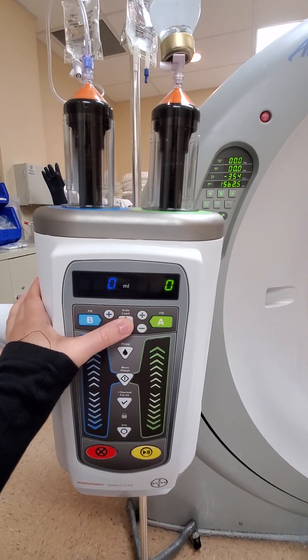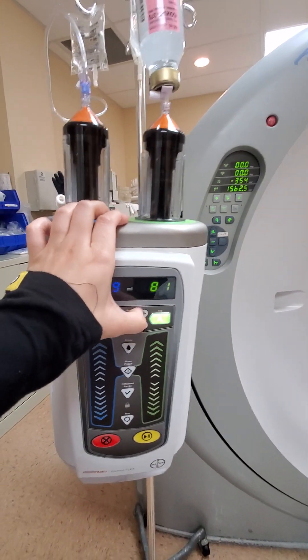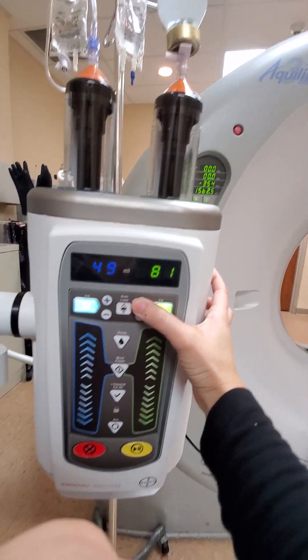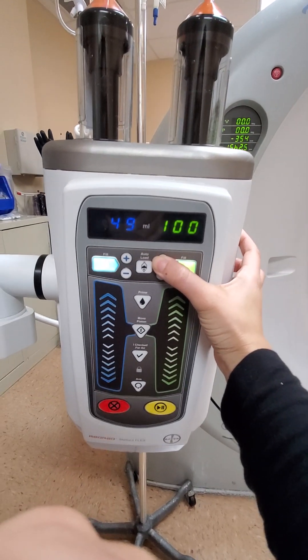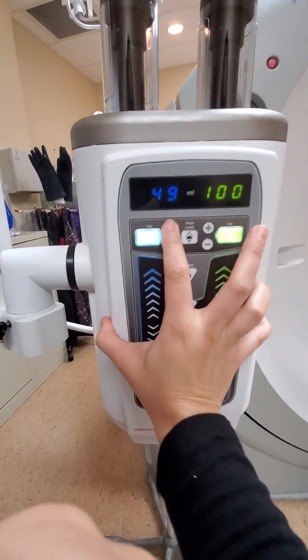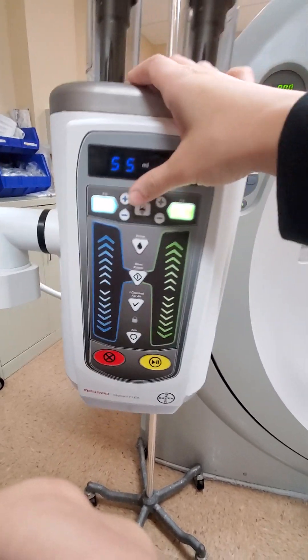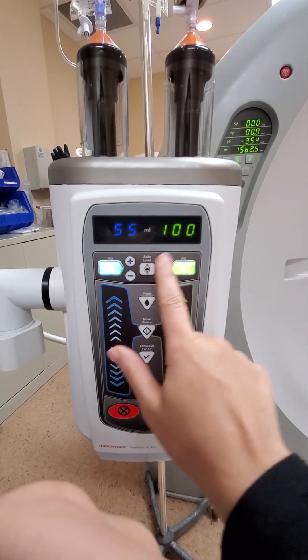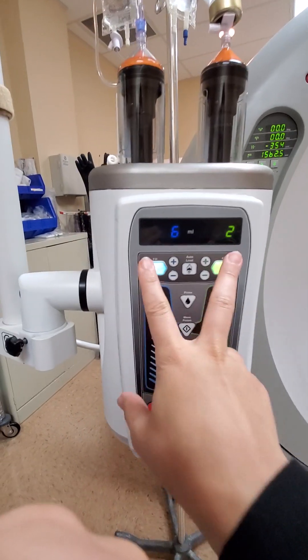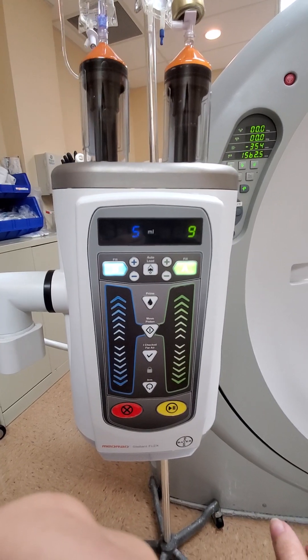To do that, you're gonna press autoload and increase the number to 100 and 55, then press B and A. You have to click that or else it won't load and then you'll come back and wonder what happened.